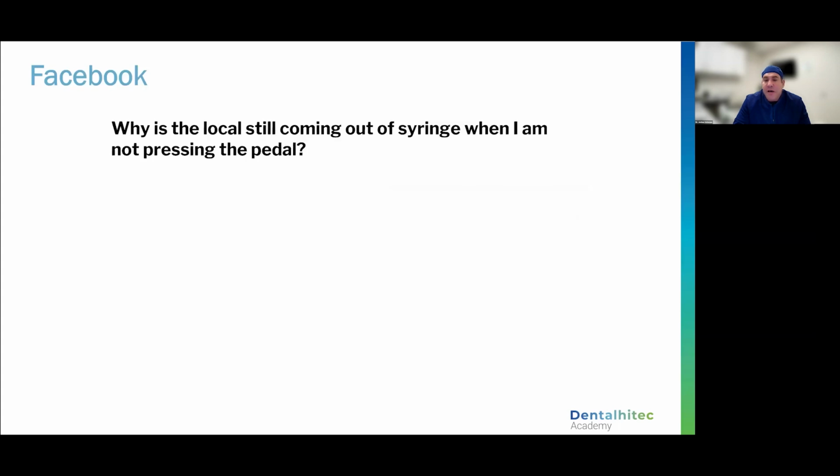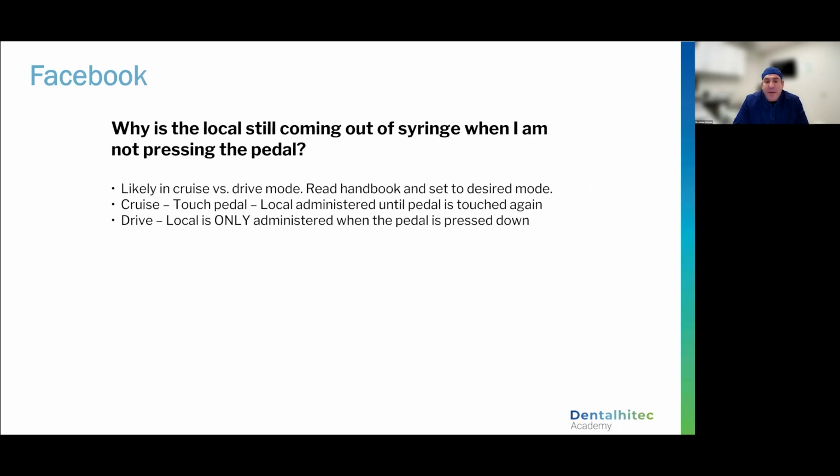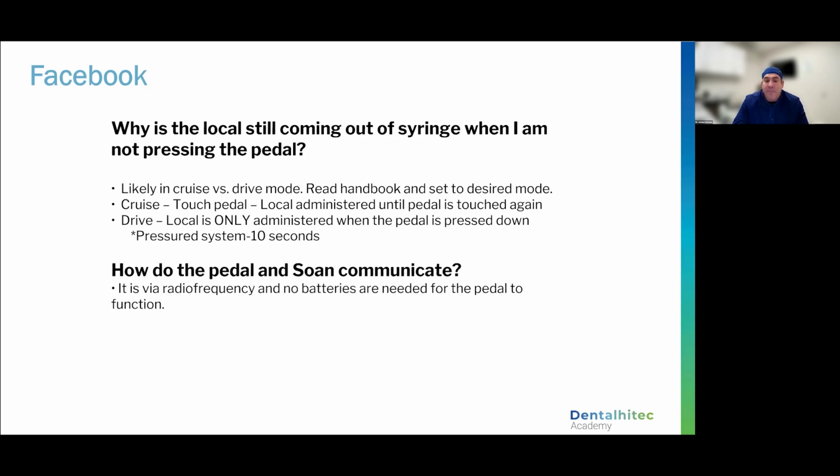Okay. Just a couple of questions from Facebook. Why is my local still coming out of the syringe when I'm not pressing the pedal? If you're not familiar with cruise and drive, there's a great video. Aaron just posted that. Please go to the Facebook group and you'll see. And just remember that the top pedal is always going to win. So if your foot is not in the correct position, you may think you're stepping on both and you may only be on the top pedal.